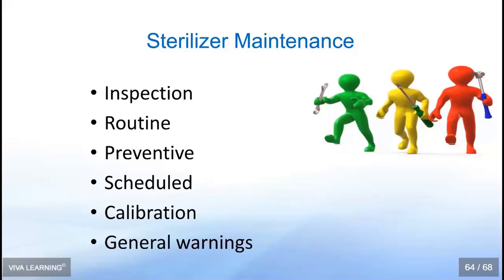Sometimes you need to replace it. It helps to have an extra one in your practice already. So if you begin to see it turning brown and showing craze lines, it's time to replace that door gasket. There are certain parts that need to be lubricated periodically. And there's a list of what they would call expendable parts. If you can have some of those selectively in your practice that are easy to replace, it can sometimes save a more expensive service call.